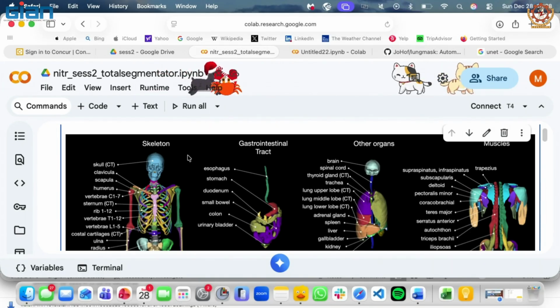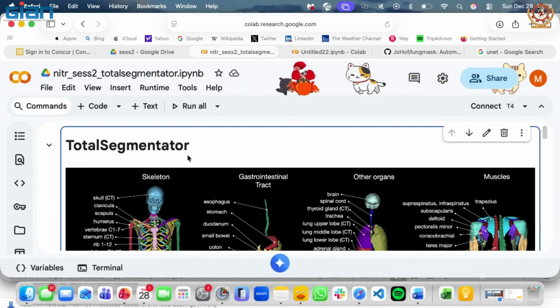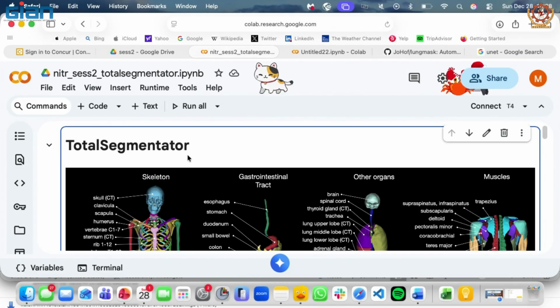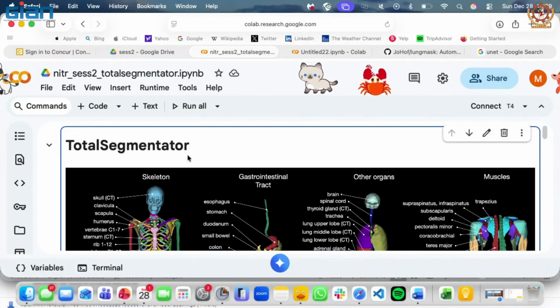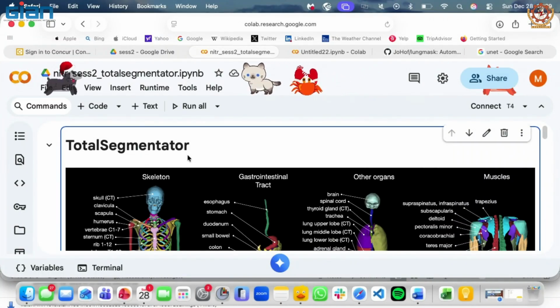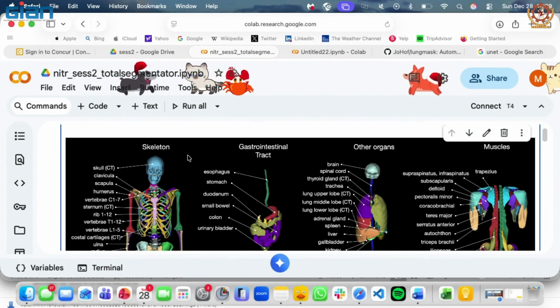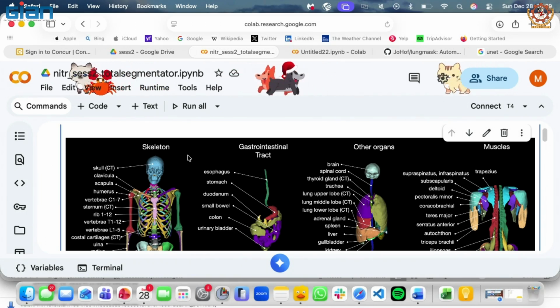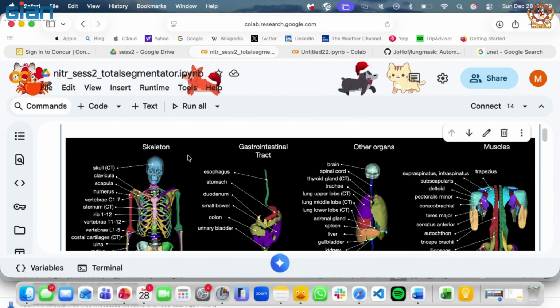Let me try to give a very quick background about TotalSegmentator, just a few minutes. I have a habit of spending too much time on LinkedIn, seeing what papers are getting published, where my friends are getting their jobs, and which jobs are open. So I came across this post. This was a project I had thought of doing, if there was enough dataset, enough labels, and enough training resources. And when I saw that this had happened, rather than being sad, I was so overwhelmed.